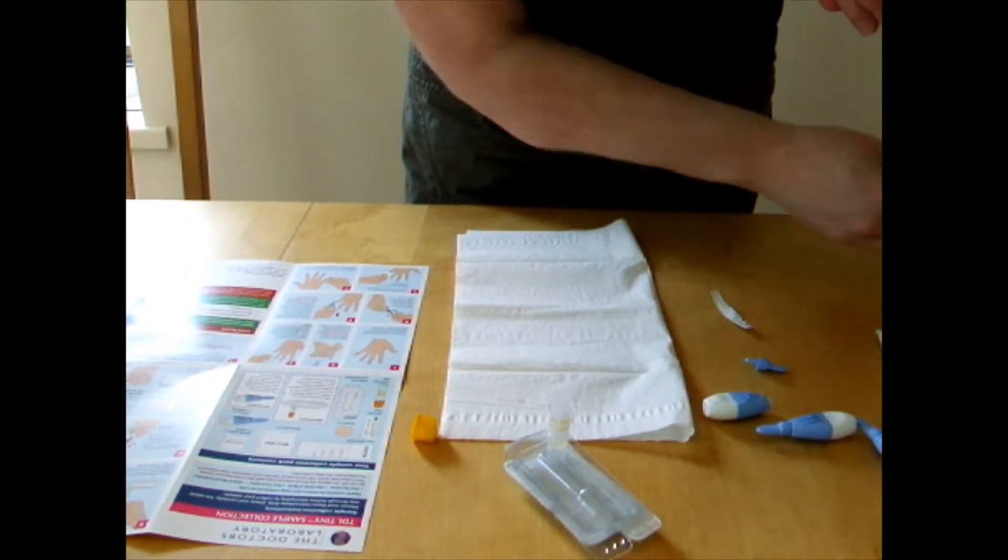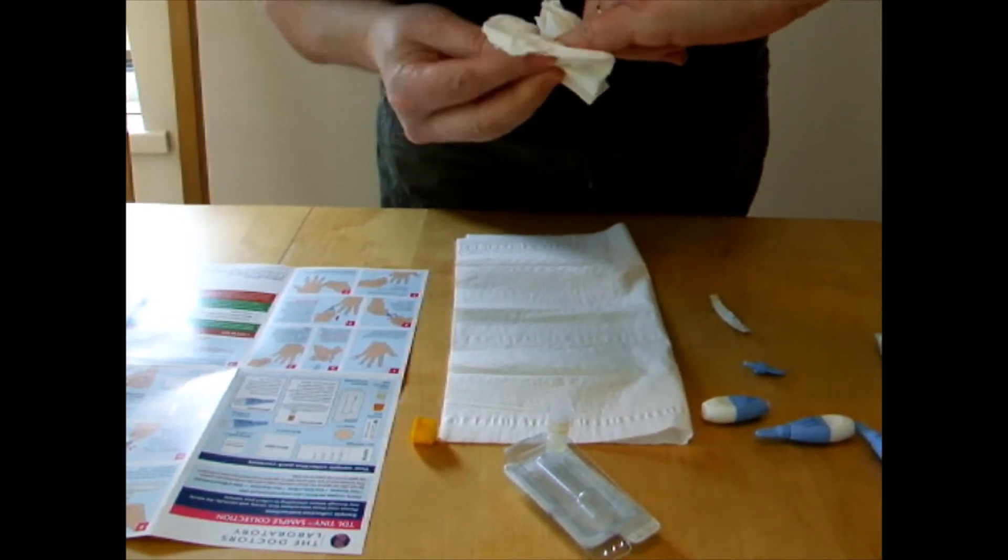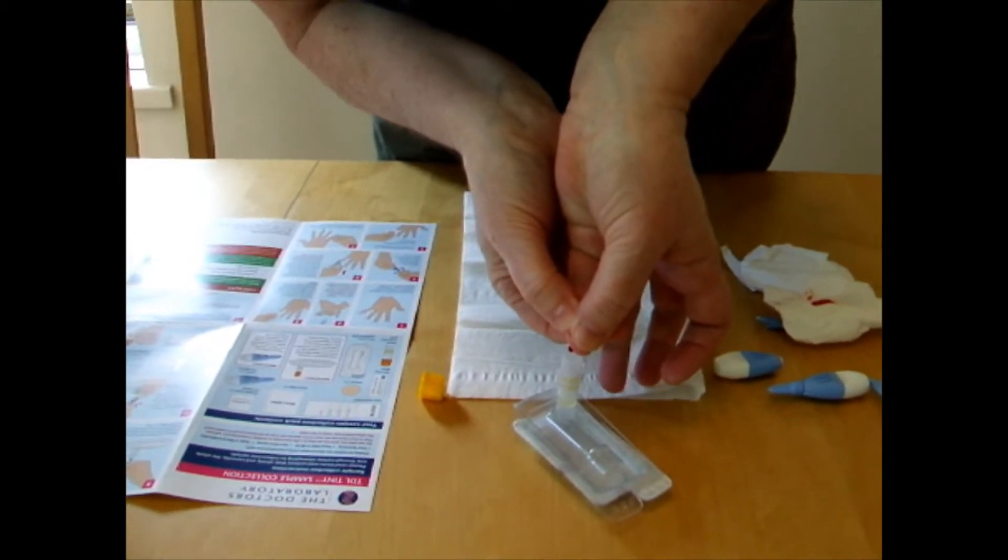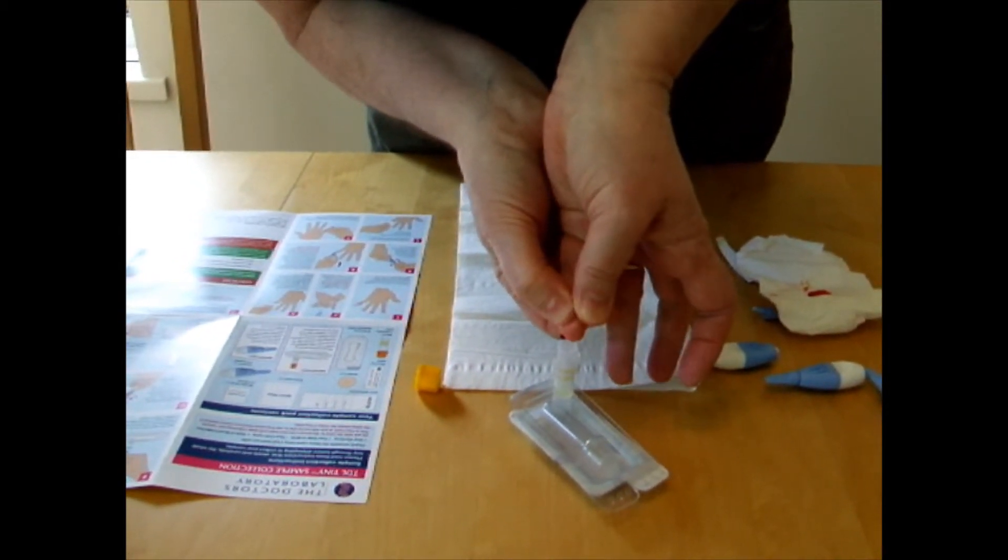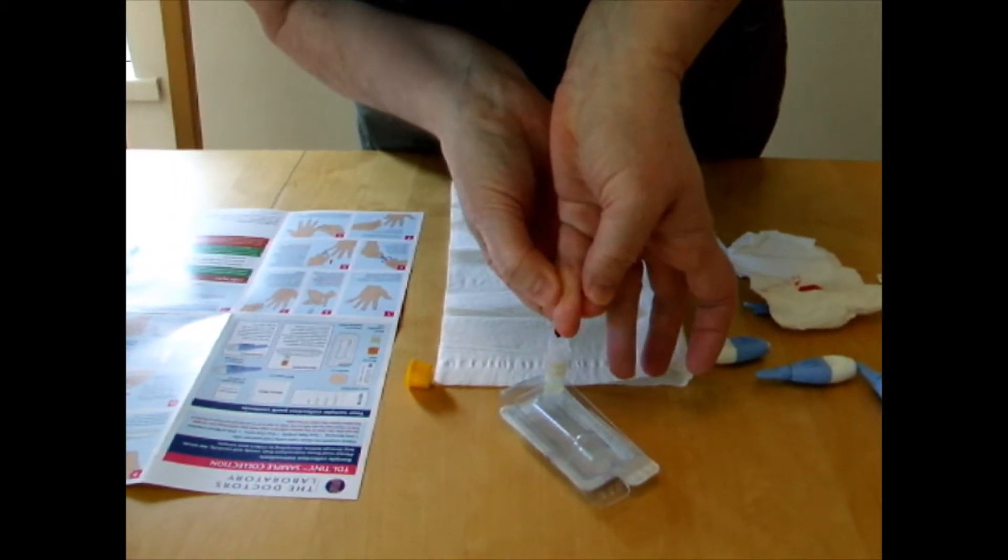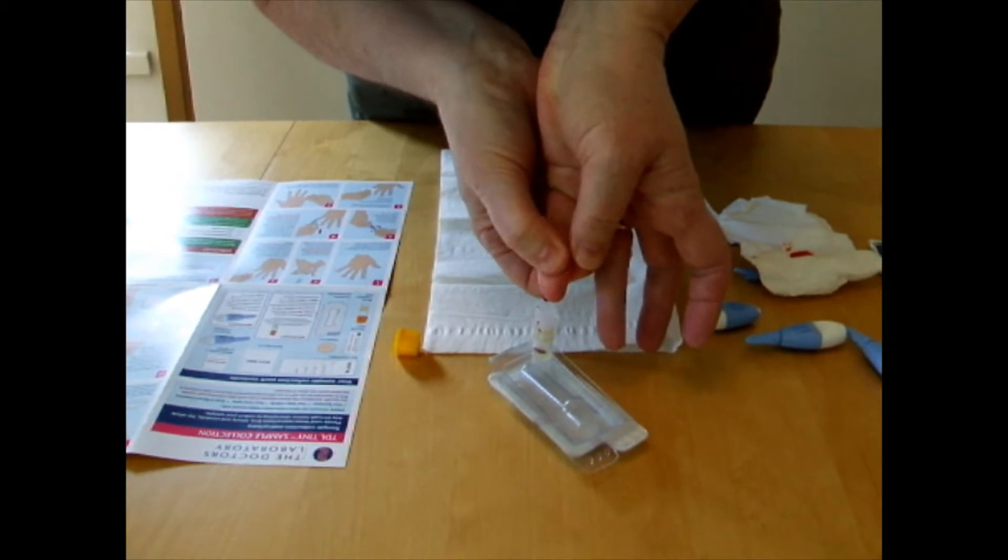If it goes around the back of your nail, wipe your finger and start again so that you can get it to flow into the tube. Just milk your finger, don't squeeze because if you squeeze it'll stop the blood flow.